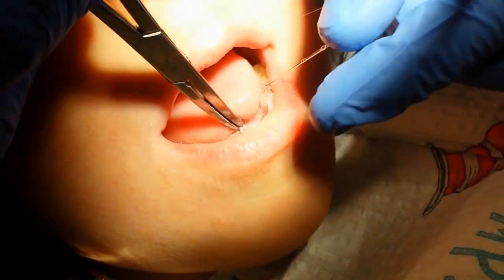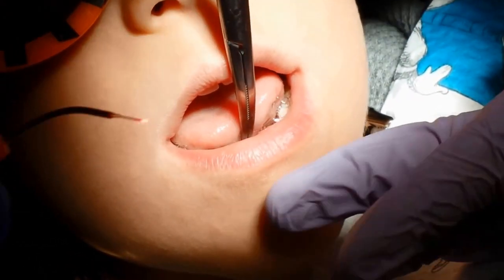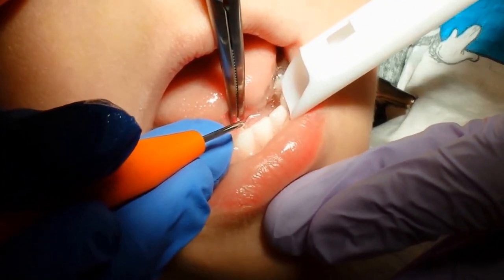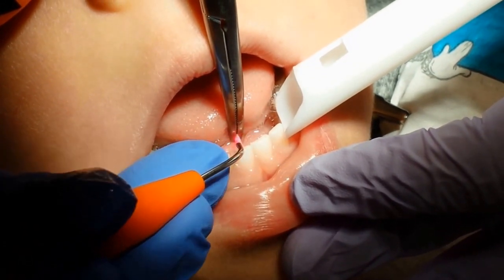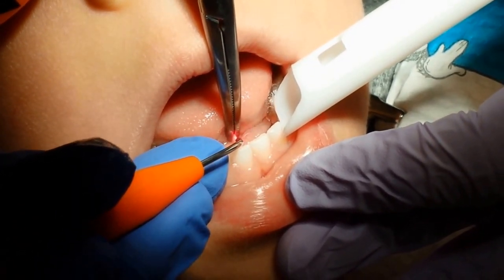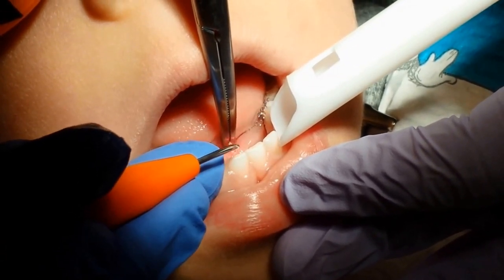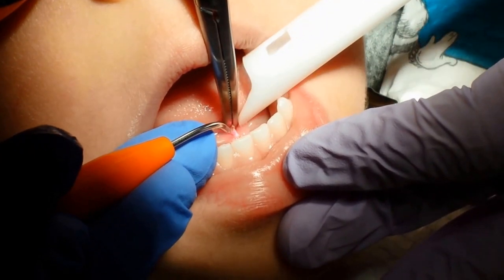I'm going to clamp onto it so I can hold onto it. I've already numbed him about two minutes ago, so while I gently pull up on that, we're going to take that skin with the diode laser. And you can start to see it — just the frenulum.